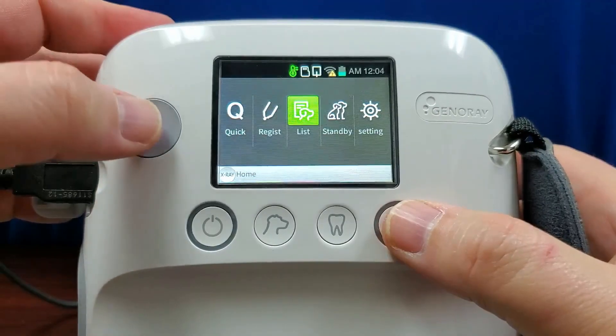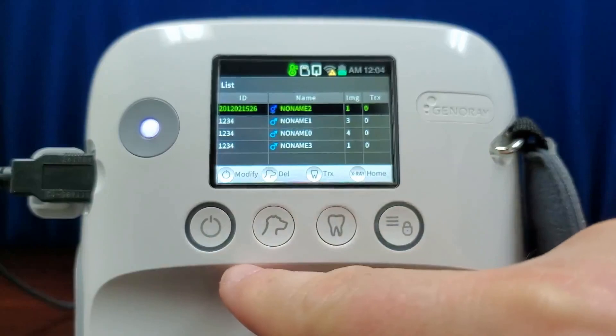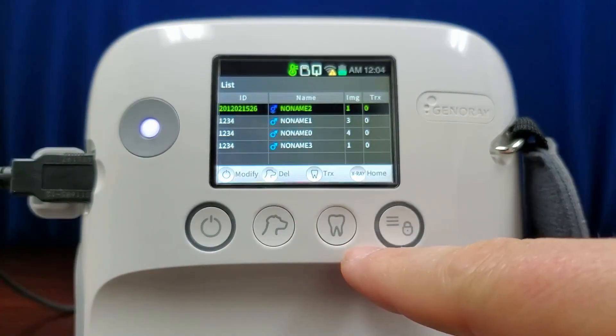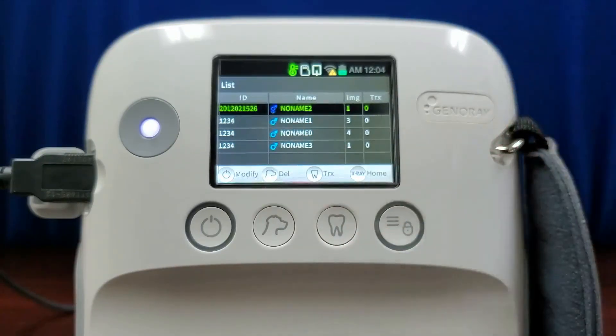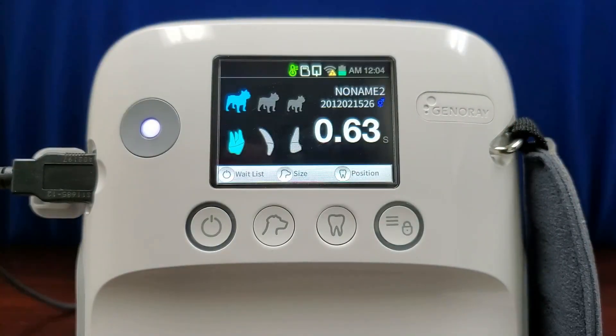Return to the list. From this menu, you can press the power button to modify the patient data, press the size button to delete the image, the position button to send the image to a server if you are connected wirelessly, or the X-ray button to return to the main screen. If you are not set up wirelessly to a server, the images on the X-ray generator can be transferred to a PC via the microSD card.